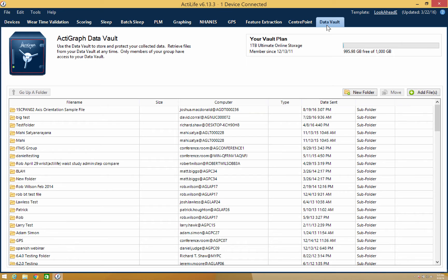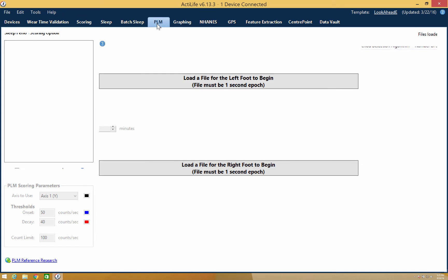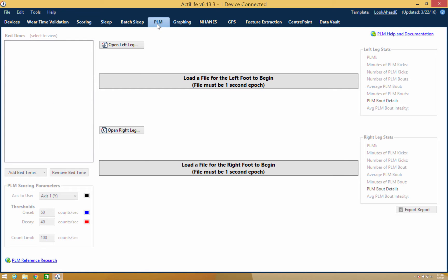There are several other tabs that are only available with the advanced sleep features. These include Batch Sleep tab, which allows you to analyze multiple sleep files at once, and the PLM tab for studying periodic leg movement.